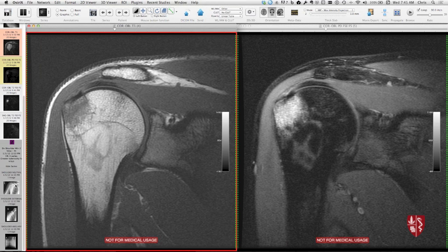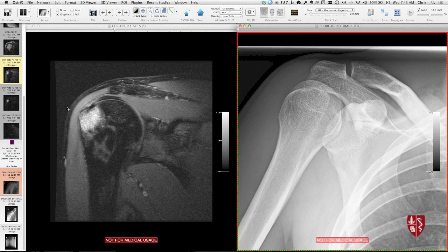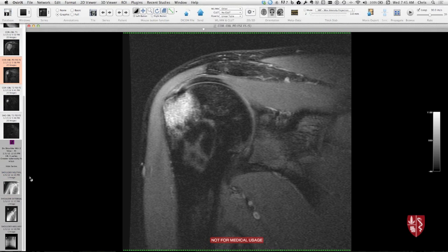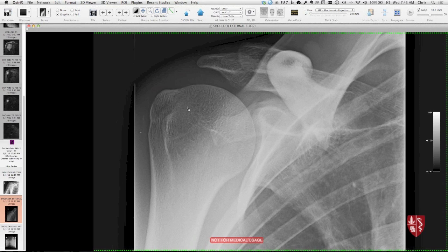And if we go back to the radiographs, I think you can see that in retrospect there's a little hairline lucency right here that corresponds with that fracture. So they can be pretty subtle. I'd like to think we would have picked this up prospectively, but a general point is that if you have a significant injury or pain that's not well explained by radiographs, MRI is a good secondary means to evaluate the patient if it's indicated to work them up further.